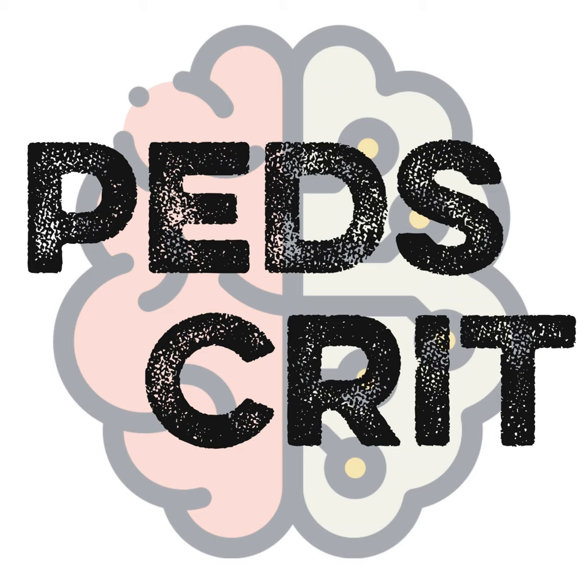Some of the kids don't need a decompression, but there are some people who believe that every VA ECMO needs to have an LA decompression. So interestingly, there is not a consensus in the ECMO world: does every kid need a decompression? What are the diagnostic criteria for this? Whether you diagnose it clinically, whether you diagnose it based on chest X-ray, whether you diagnose it based on a cath or an echocardiogram, there is not a great consensus.